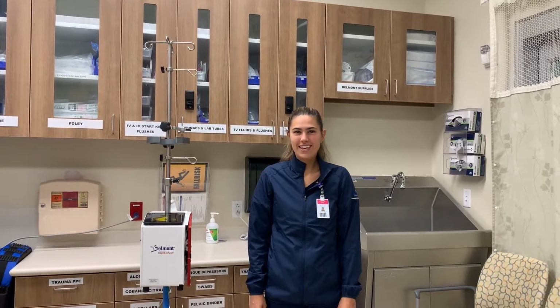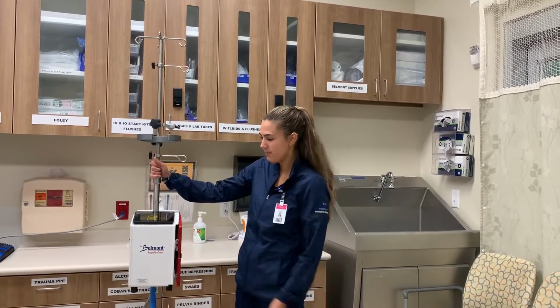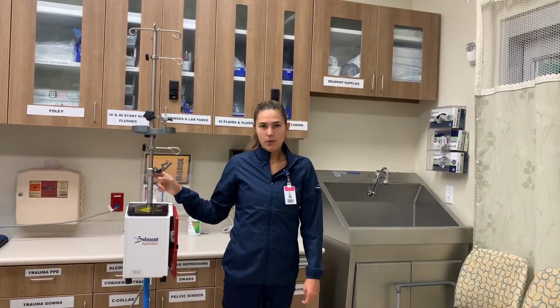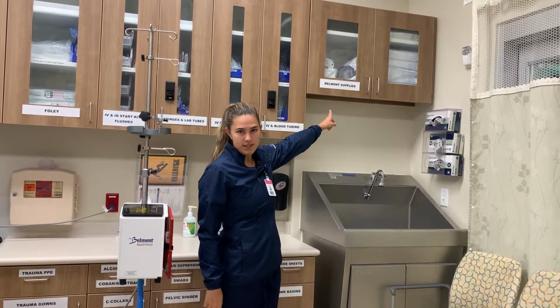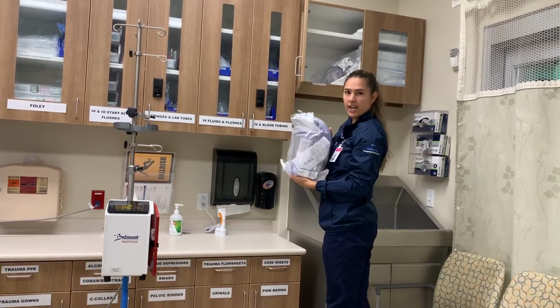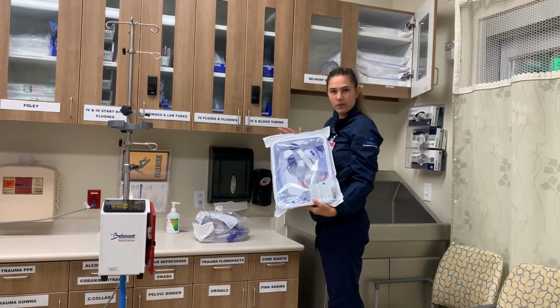I'm a nurse at the Heber Valley Emergency Department, and I'm going to walk you through how to set up the Belmont Rapid Infuser. Supplies can be found in both trauma rooms, Trauma 1 and Trauma 2. They are in the cabinet labeled Belmont Supplies. I'm going to grab the 3-liter canister and the Belmont tubing, and that's everything we're going to need.